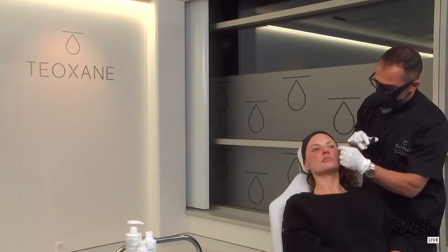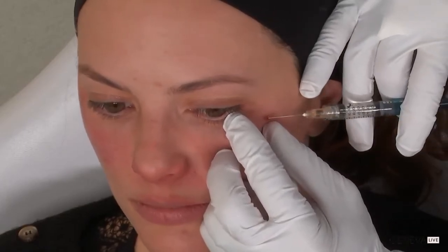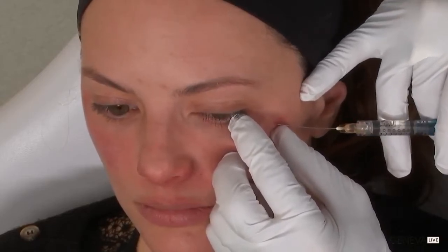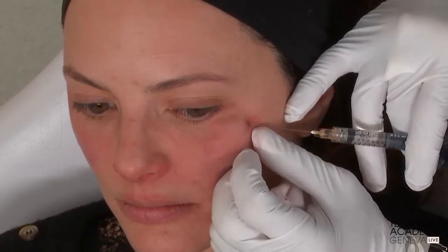The reason why I don't like to use needles on the infraorbital region is just to avoid that pain. Actually, every needling is painful, and also I want to avoid the risk of bruising the patient, because as you see here, I don't expect any bruising at all. This is really true what you said, Francesco. We use a cannula in this area not for safety reasons. It's mostly to avoid the bruising that each time you can get when you cross the skin with a needle.